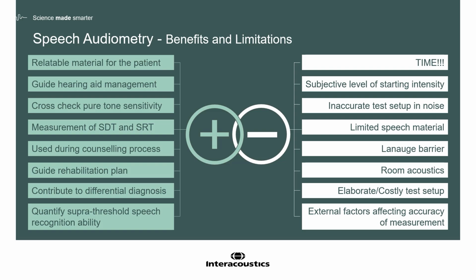Now, we can all agree why speech testing can be very beneficial, and there are plenty of articles suggesting why it should be done. But what exactly prevents some clinicians from doing it? We certainly know that in real-life situations, it can be difficult to include speech audiometry within our appointments despite the advantages of including it. Some of these obstacles are time, access to testing materials, objective and clear starting points for clear audibility for the patient, room setup, and more.